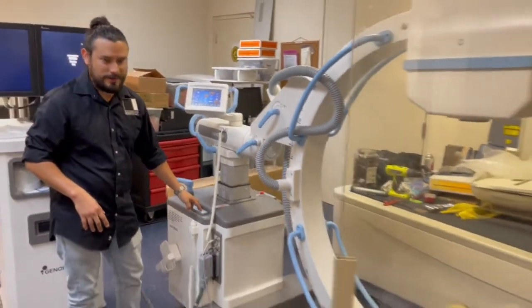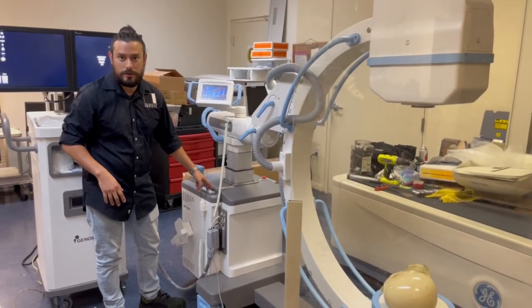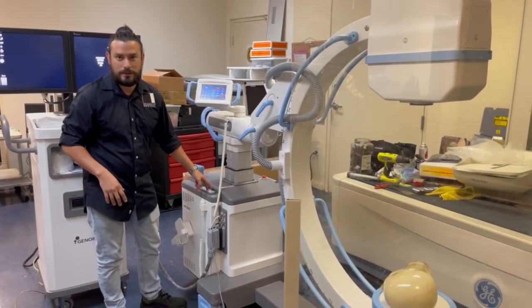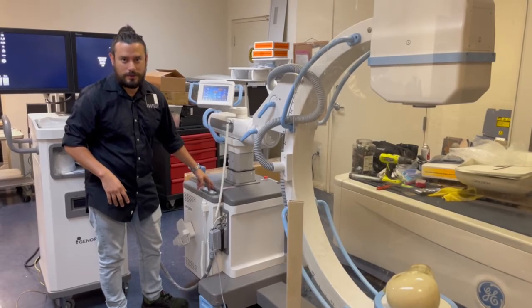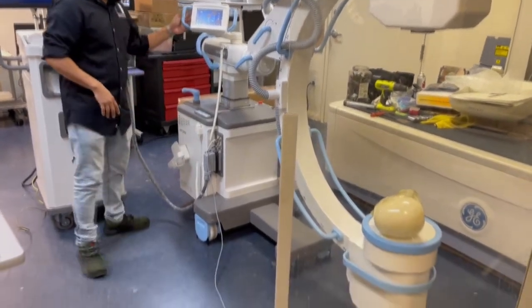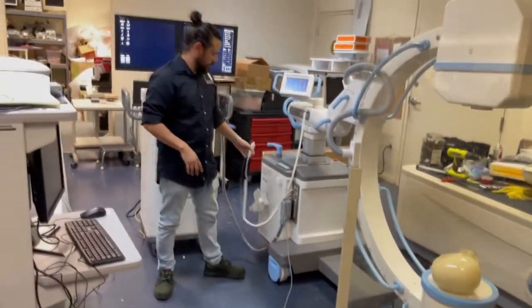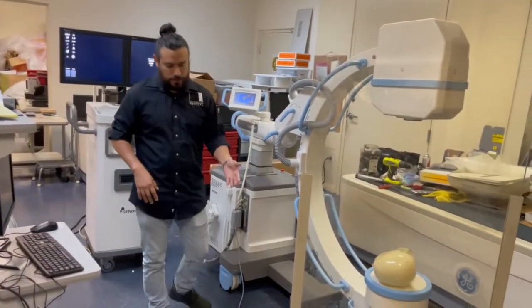Another nice feature: it has a sensor that will tell you if you're going too low. That indicator is telling you you're too low, but you can still go lower. To take a shot, there's a regular hand switch and also a foot switch.